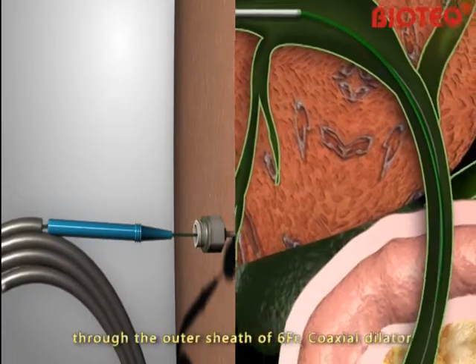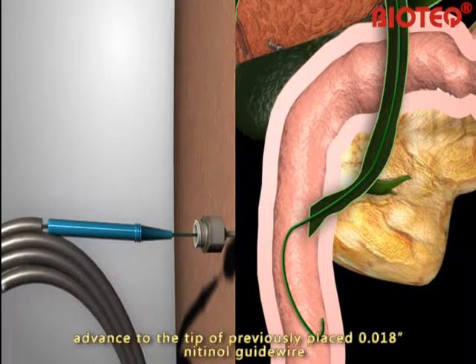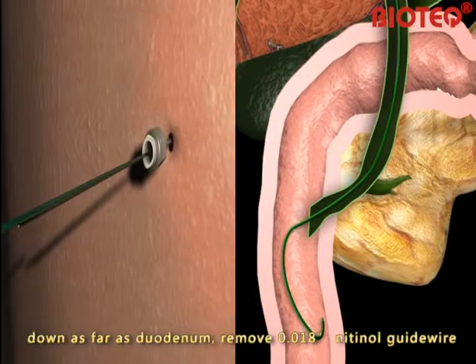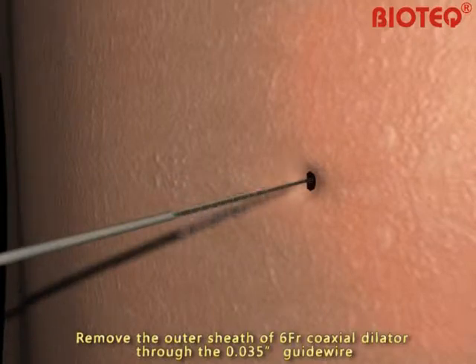Introduce the 0.035-inch guide wire through the outer sheath of the 6-French gauge coaxial dilator and advance to the tip of the previously placed 0.018-inch Nitinol guide wire, down as far as the duodenum. Remove the 0.018-inch Nitinol guide wire and remove the outer sheath of the 6-French gauge coaxial dilator through the 0.035-inch guide wire.